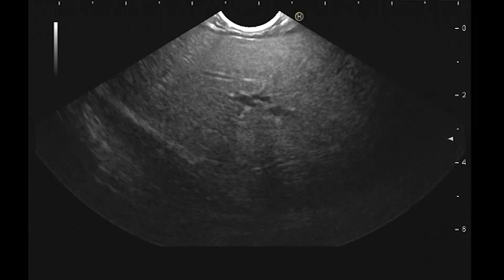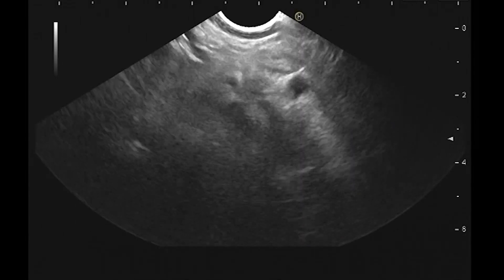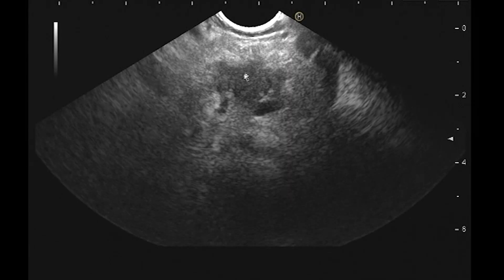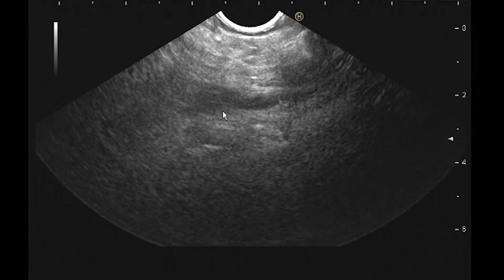There's her liver. Looks good. Torquing. There's the vein sort of coming out. And right away, you can see a lesion right there.